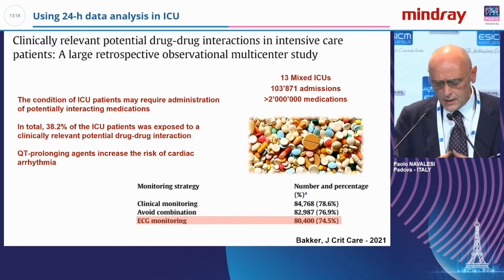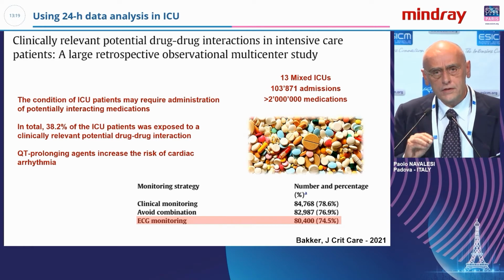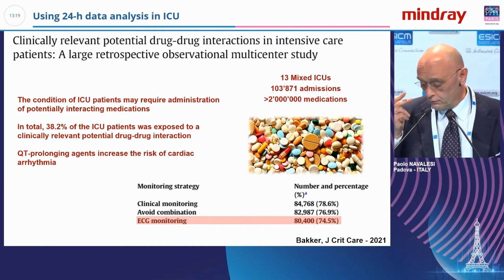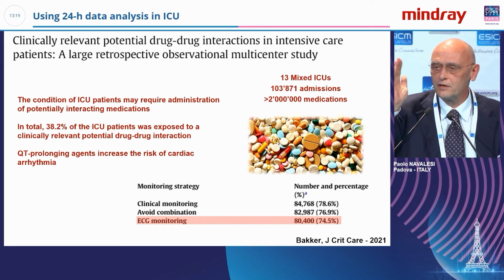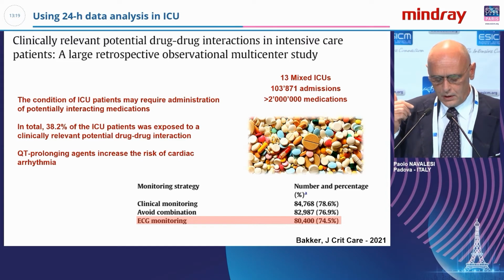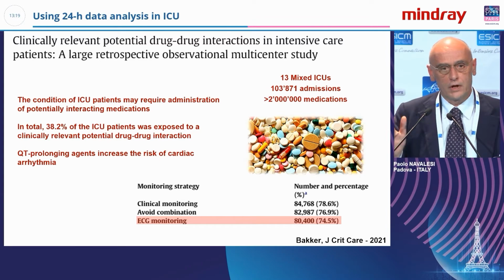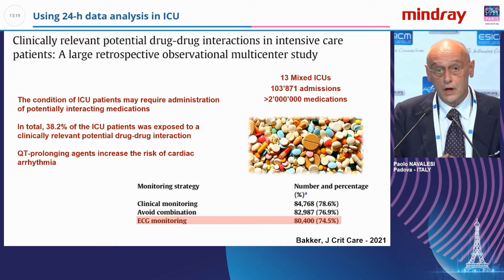And in this study, published 1 year ago by Becker and co-workers in the Journal of Critical Care, the authors found that the strategy to prevent this risk was related to the combination of 3 different aspects: clinical monitoring, breath by breath, beat by beat, I mean, immediate monitoring, avoiding combination of drugs, which is not always possible, and the EKG monitoring. Now, I believe that the information that we receive over a longer period of time is important. For instance, as soon as we interrupt a drug infusion, we don't observe maybe the change immediately, but it is important to see what happens in a longer period of time.